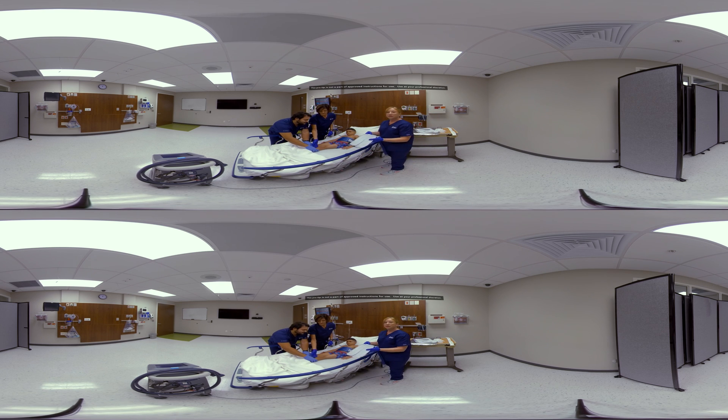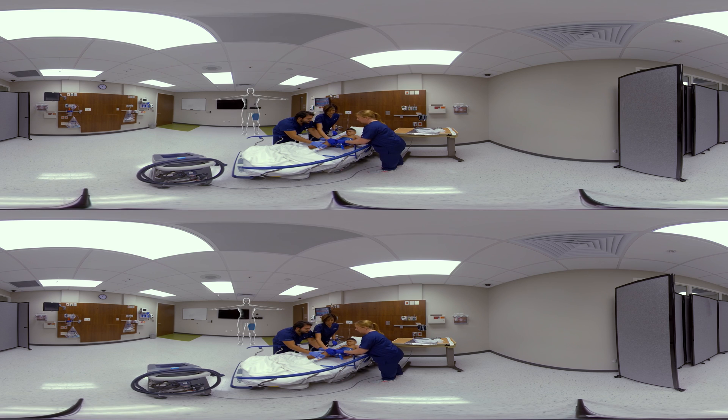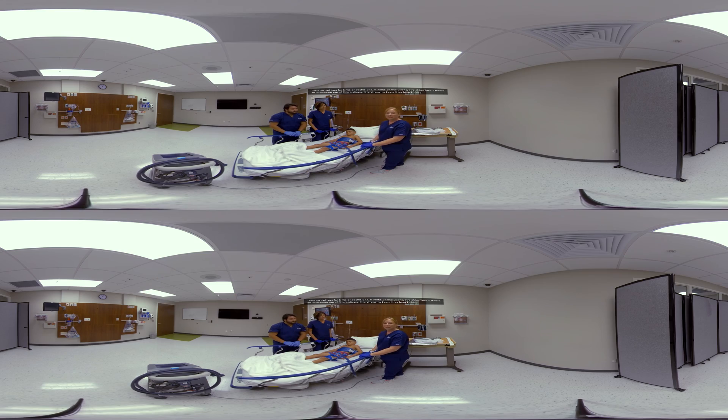Should you choose to use the small universal pad with the cloth liner in place, you can place it around the patient and use the velcro straps that come in the package in order to secure it next to the patient's skin. We want to make sure that the hoses are pointing towards the side of the bed that the Arctic Sun is on and that they're not kinked for optimal water flow.